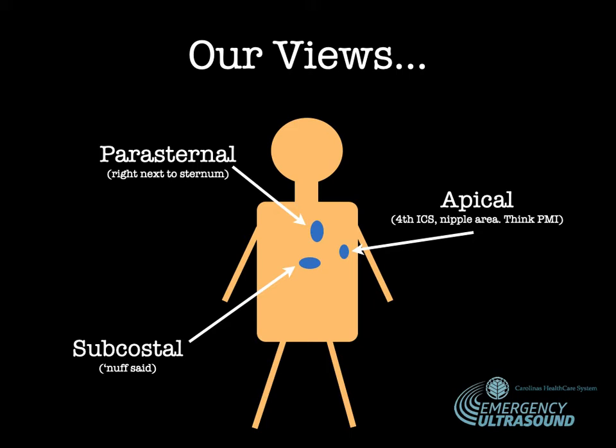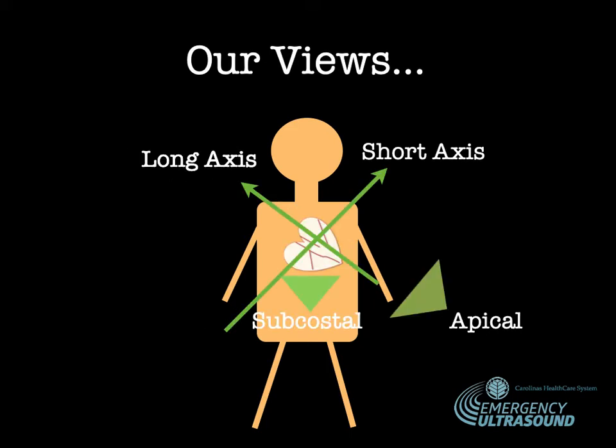your costal margin. So our views, we're imaging in the long axis of the heart in our parasternal long axis. We're imaging in the short axis of the heart, goes without saying, in our short axis. Then the apical four is going to be a four-chamber view in which we're looking at all four chambers of the heart. And our subcostal view is also a four-chamber view as well.